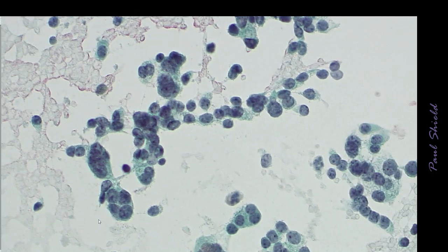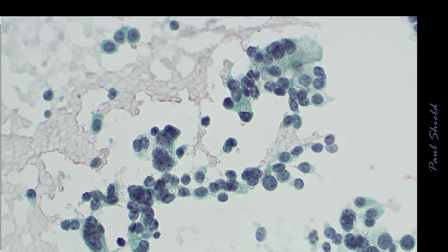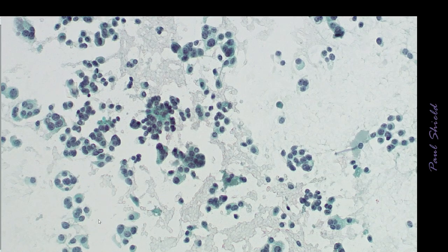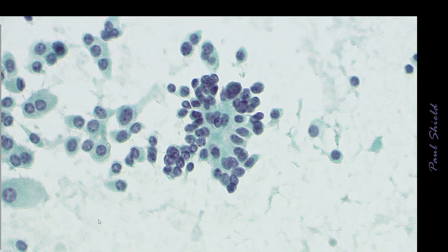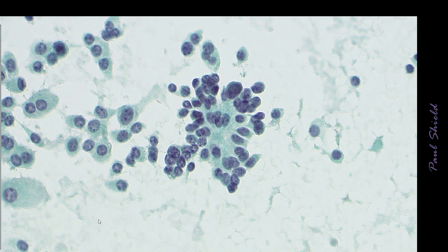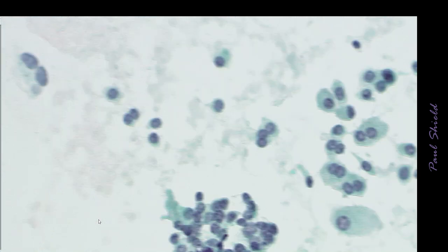Here, I'm not sure I can call that stippled chromatin, but it's quite a delicate, powdery chromatin really. Here's a grouping, and it's showing again that semicircle of cells.